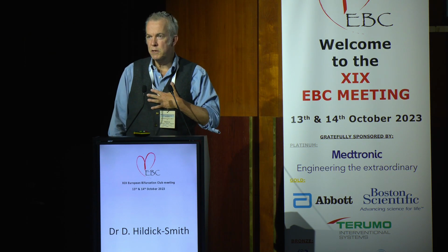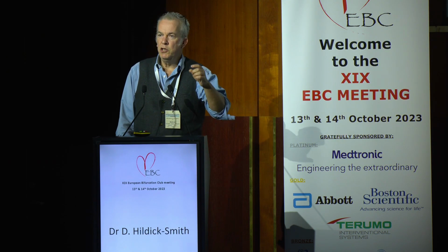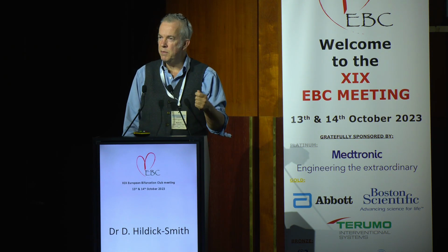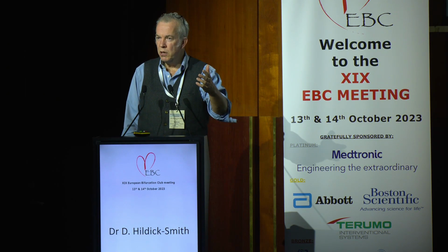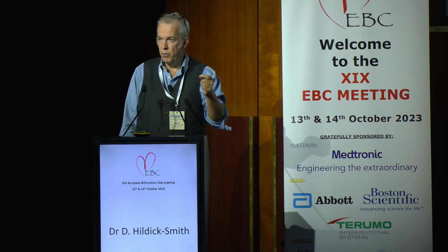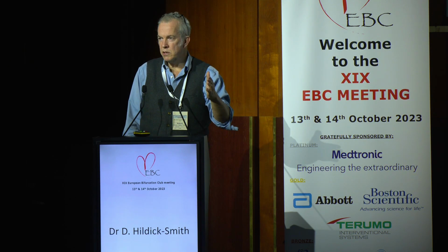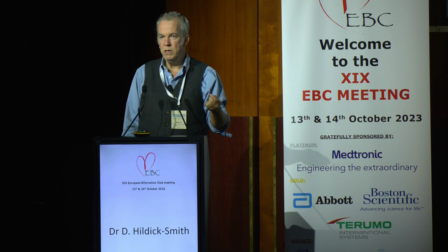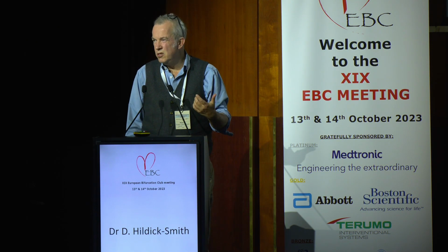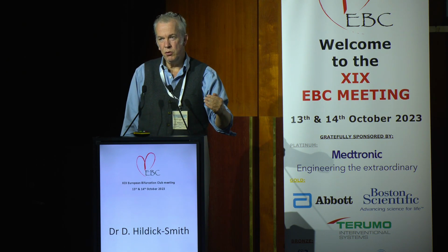Certainly my personal experience in the catheter lab is that whereas we used to think that late stent thrombosis was a feature of Taxus and Cypher stents and doesn't really happen anymore, that's not right. They do come back. Sometimes it's 5 years, 8 years, 10 years. You see someone come back with either acute, very late, or acute on chronic, very late stent thrombosis. And you've got a real problem to deal with then, with perhaps a long stented segment, which has become rigid, perhaps a bit calcified, and can be very difficult to treat. How do you treat that successfully for the long term for that patient? So that was my personal experience of this nagging doubt, that these things do come back. It's as if the clock was just moved forward by having drug-eluting rather than bare metal stents. There's still a problem here.